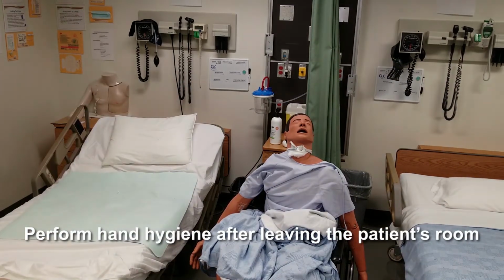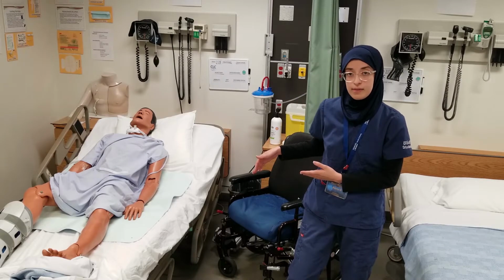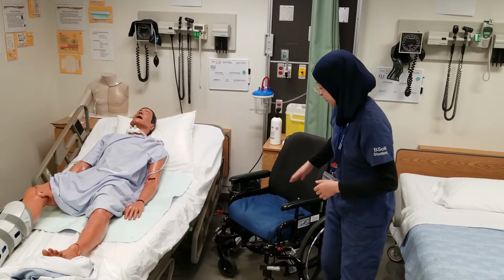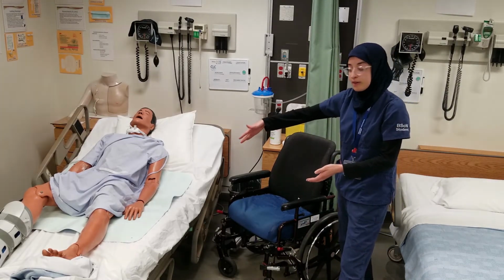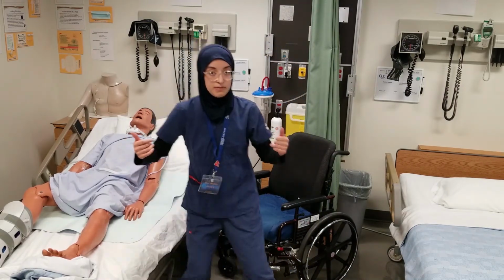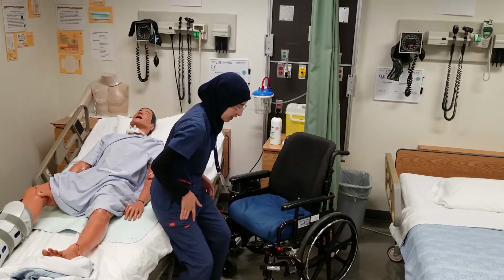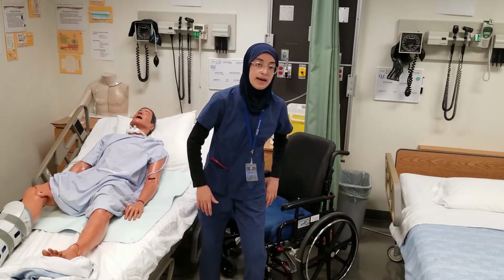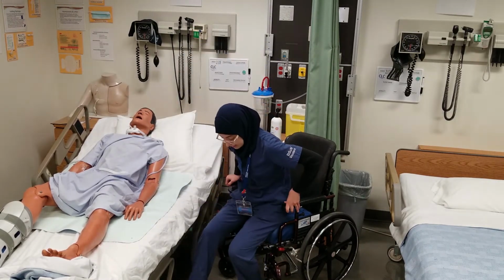Bye. So now we're going to go over how to do that with the wheelchair at the head of the bed. The procedure going up to that point is still the same. We're just going to make sure that when we're setting up the wheelchair, it's at the head of the bed, facing at a 45-degree angle. Again, the patient is going to get up, and they're going to pivot to the chair. So we want to make sure that we're placing it in a position where it's not too far where they have to get up and pivot all the way back, but one where they can just get up, pivot, and the chair is right there.